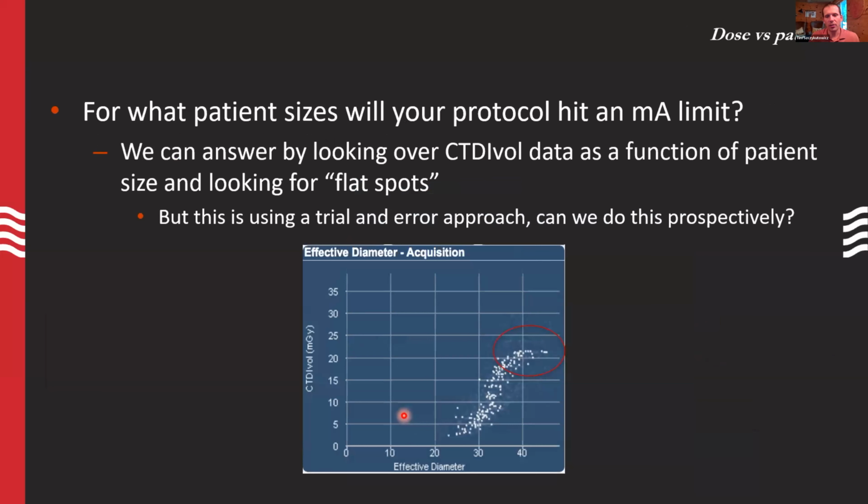All right, so I think it's really important to have analytics like this, because you can start to answer lots of questions and do really more advanced optimization. So we can ask questions like, what size patient will our protocol hit an mA limit? If I'm sitting there looking at my dose monitoring system and I see, okay, at 40 centimeters effective diameter, I hit a limit, then I know I got to do something. I'm either going to modify the whole protocol to go a little slower so that I can get more dose output up here, or I'll make a new protocol that maybe uses a higher kV, is a little slower than the old protocol, something like that, to get more dose output so that I'm not flatlined out like this anymore.